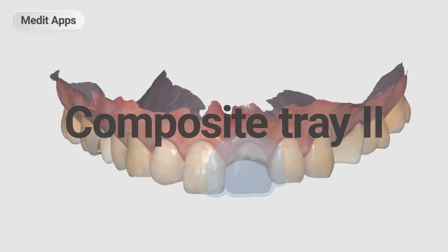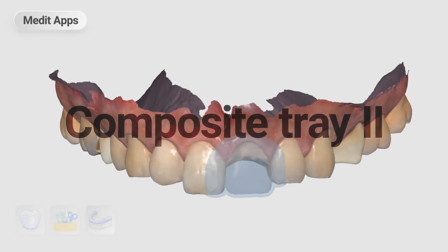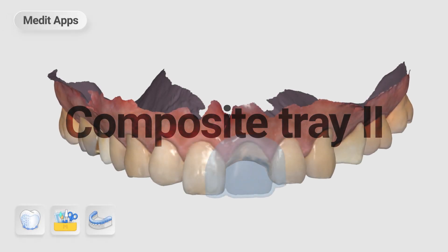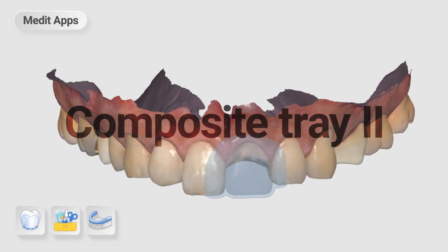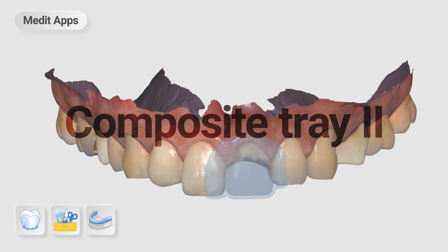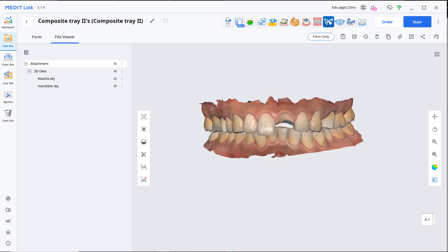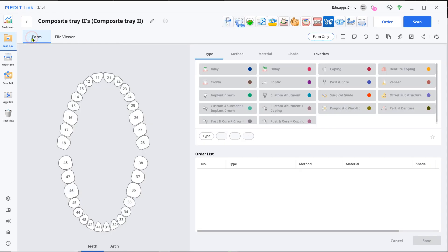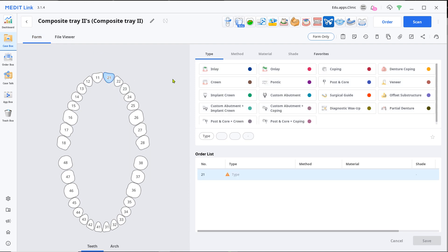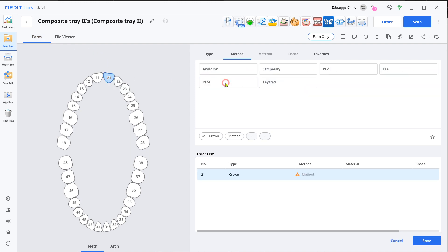This is a quick demonstration on how to design a composite resin tray for missing teeth with the Medit apps. First, go to the form tab and set the missing teeth as a crown, then temporary.